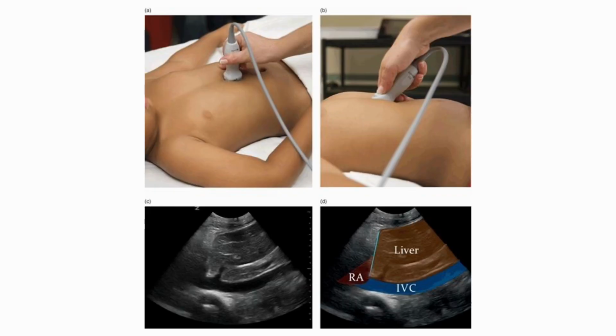So here we can see different ways to hold the probe. You can see where they've placed the probe just to the right of the subxiphoid, right under the rib cage. On the bottom, it shows the structures we're seeing. On the very right, if this was a live view, you'd see the RA contracting. Extending down from that is the IVC, with some other vessel running off to the liver right above it.